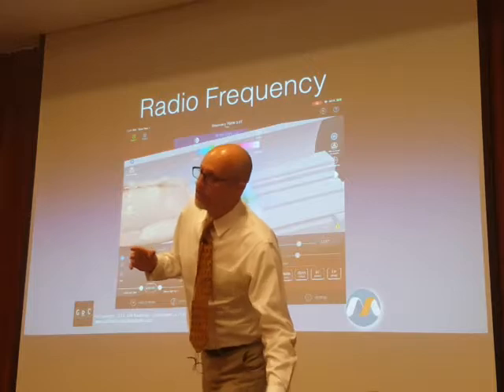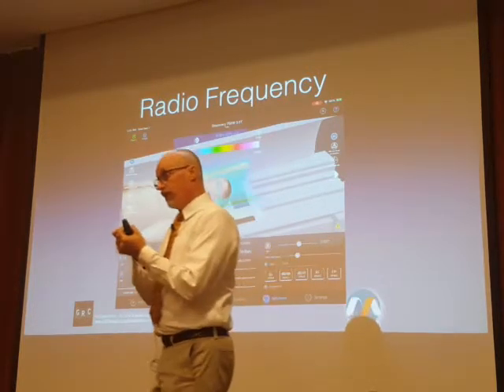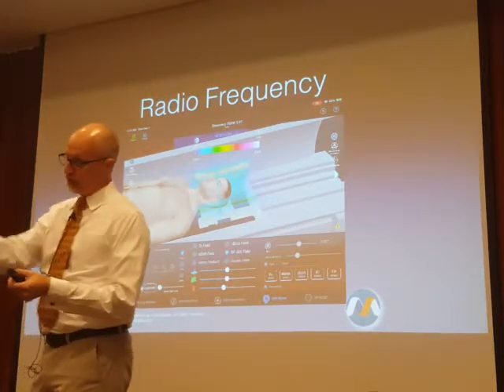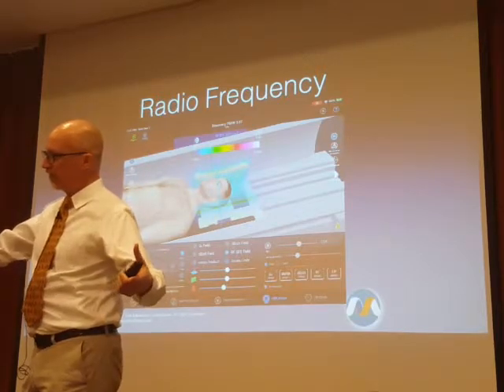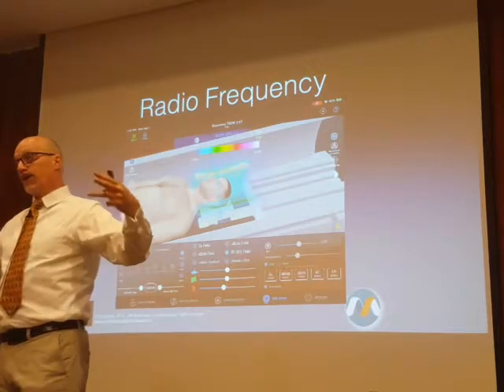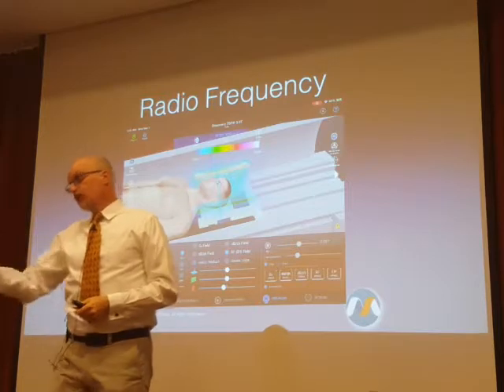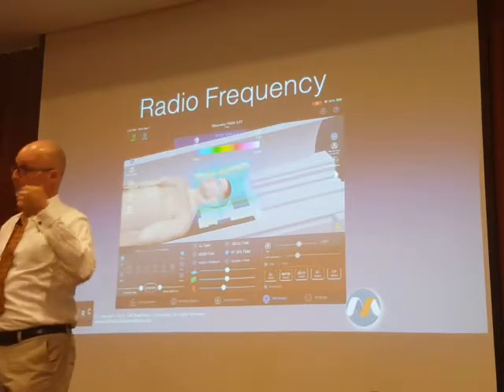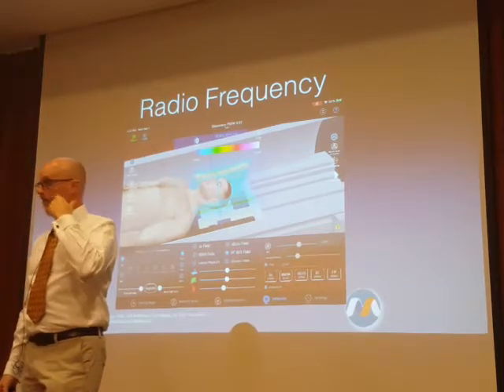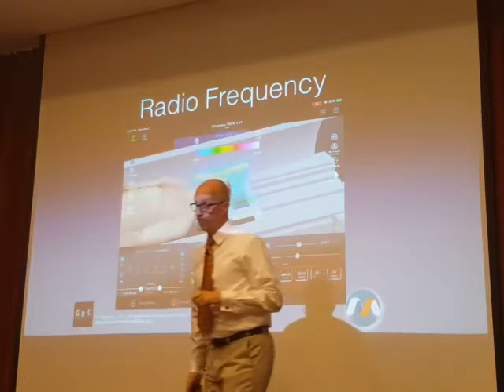So it's a two-pronged problem for our obese patients. Because they're large, we're going to transmit more power total to compensate for their larger mass. And because of their body habitus, they're going to be closer to the transmitting elements. So they're closer, which is more dangerous, and we're transmitting more power, which is more dangerous. So the padding, especially for our large patients, is extremely important to try and prevent burn injuries.